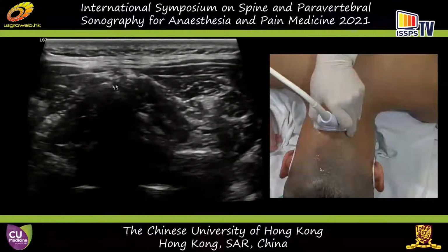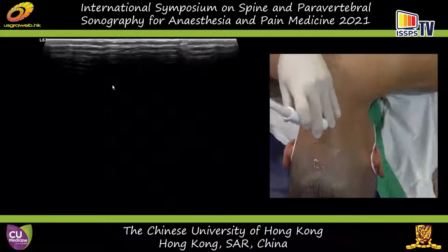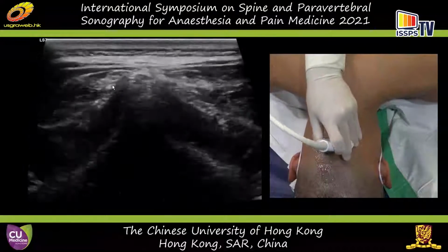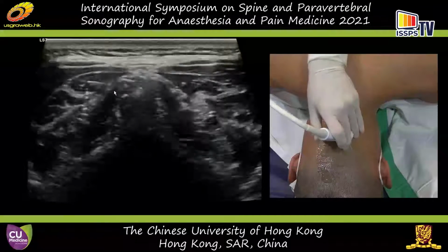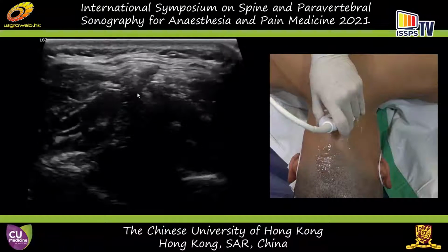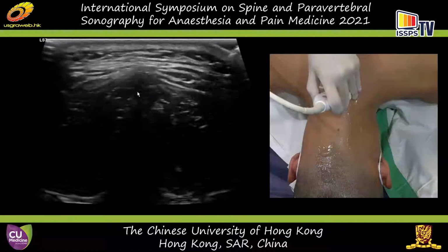Then we can go to C3. Go back to C2, and then go to C3, and then go to C4, C5, C6, and P1.